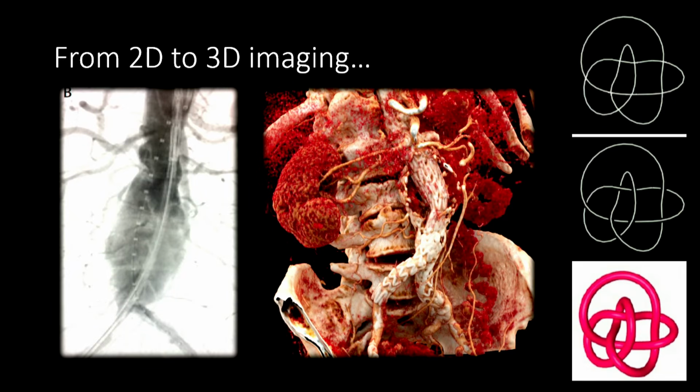So let's get started. In the operating room, we are still in this good old day of 2D imaging. What I mean by 2D imaging is 2D angiography, whether it is fluoroscopy or a 2D angio, whether it is a mobile C-arm or a fixed C-arm.